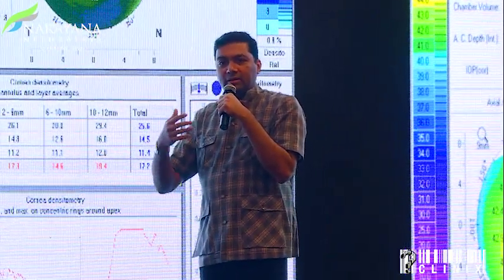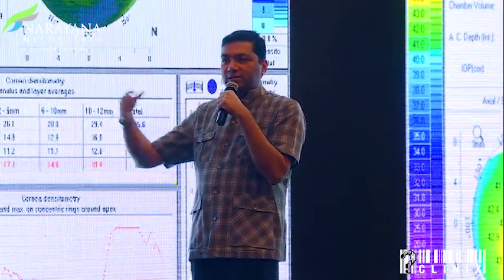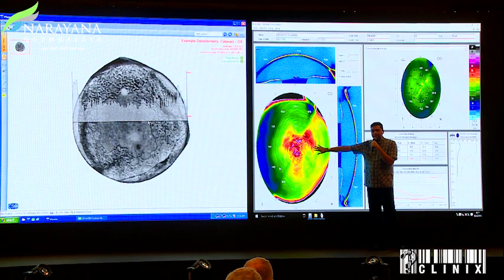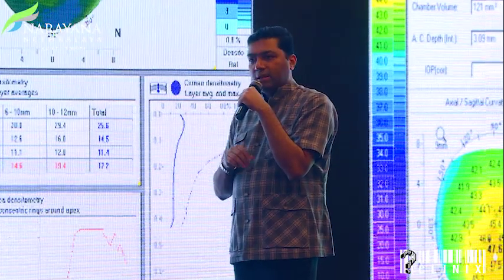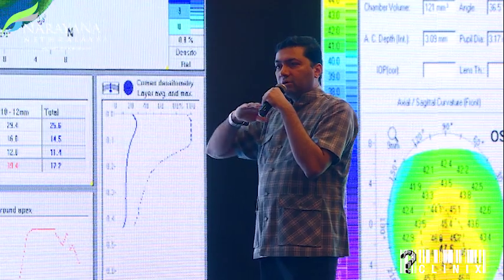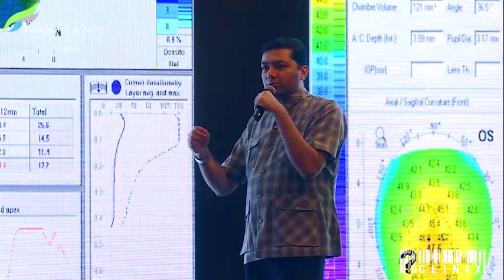I did a cross-linking. My Pachy has now gone to 230. Did I burn the cornea too much? And I said, just wait for some time. And then over a month or 2 months, it recovers. I think it's just related to the change of how the densitometry is behaving. So Rohit, you say that the Pachy which you get after cross-linking is not reliable, so it's better to do an ultrasonic Pachy? Yes. You don't take it at face value? Exactly. We did this, it's in IGO, I'll send you the article, that the more the densitometry, all your values are affected, and the worst value to be affected by post-cross-linking densitometry is pachymetry.